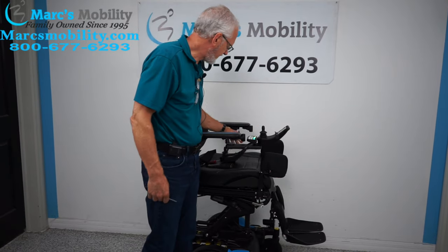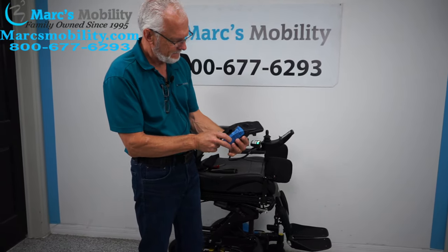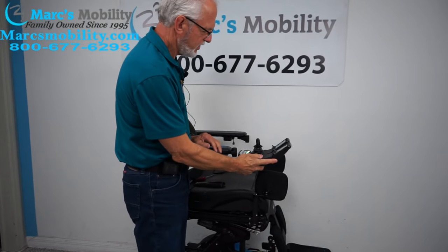This is how you change the joystick. This is the joystick you'll be getting from me. You can see the plug goes into here. This is the joystick — it's the same one that's on your chair now.